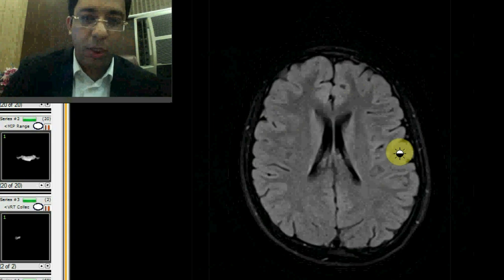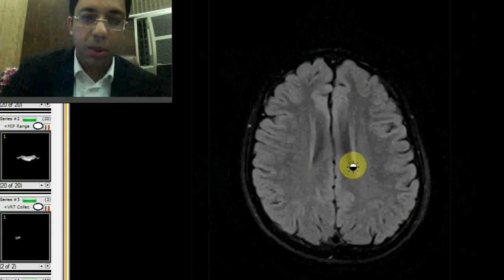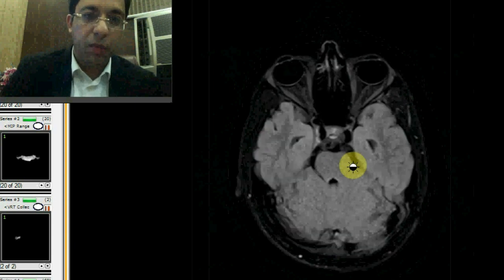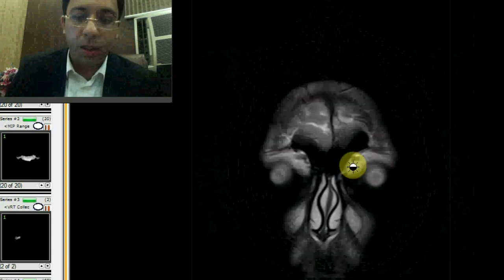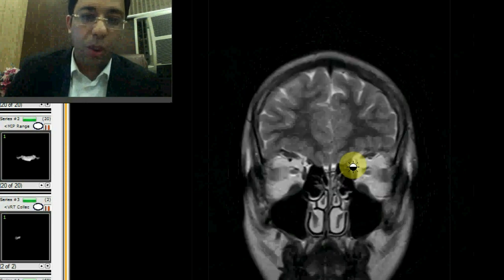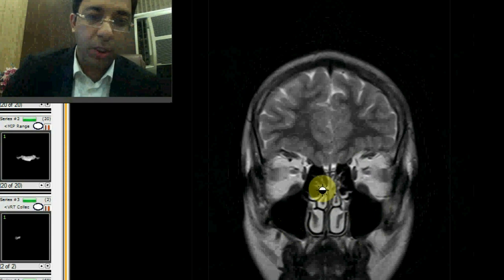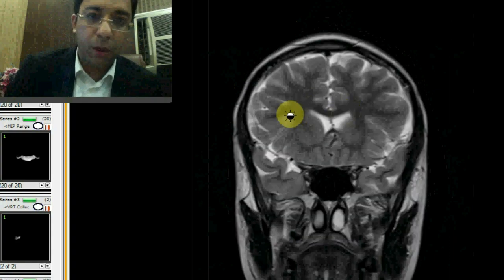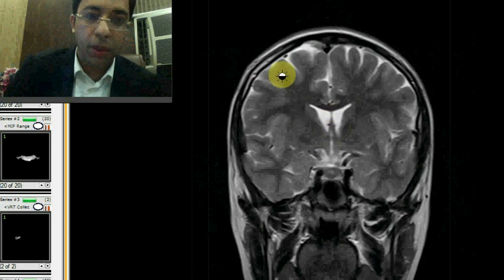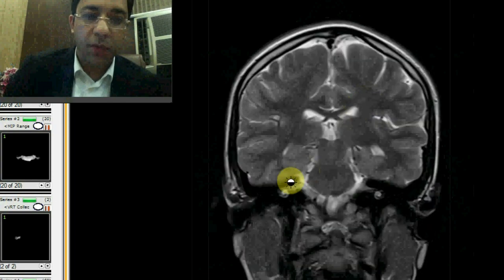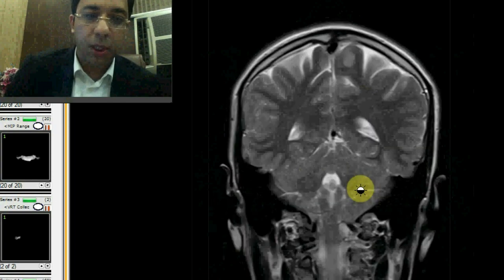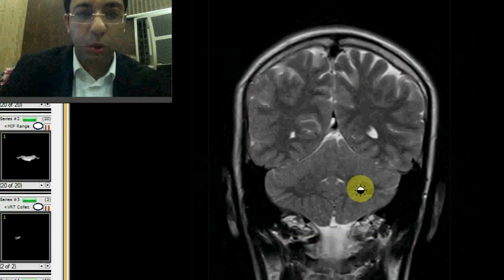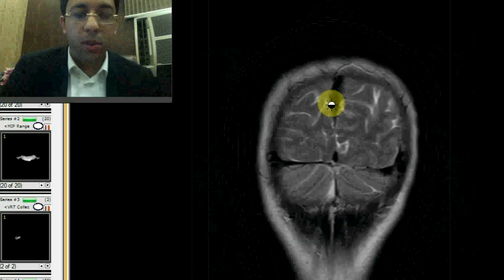On the FLAIR sequence, you can appreciate the choroid plexus within the ventricle. FLAIR is done routinely in all brain MRI studies. Now looking at a coronal T2 weighted image, you can see the maxillary sinuses, nasal turbinates, nasal septum, olfactory bulbs, corpus callosum, ventricles, interventricular septum, sylvian fissure, gray-white matter differentiation, the seventh and eighth nerve complex, the cerebellum, and the tentorium and falx cerebri.